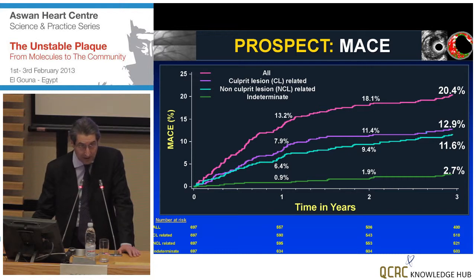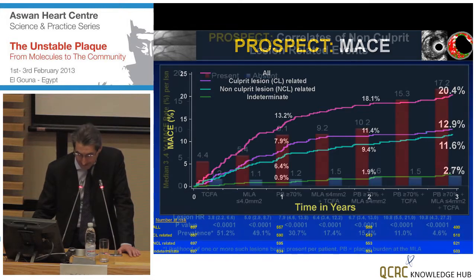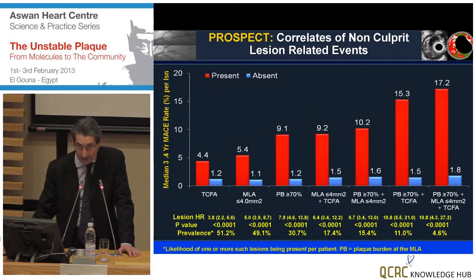Probably, if you consider diabetic patients or patients with multiple risk factors, this increases, and this explains why surgery, when you shoot to all arteries, achieved a better goal than when you just treat the tip of the iceberg, so the most severe plaque in high-risk conditions such as diabetes. But let's come back to the additional information that intravascular ultrasound offers for non-culprit segments.